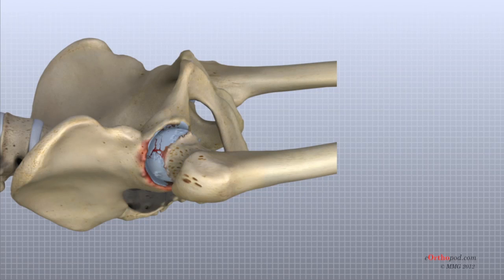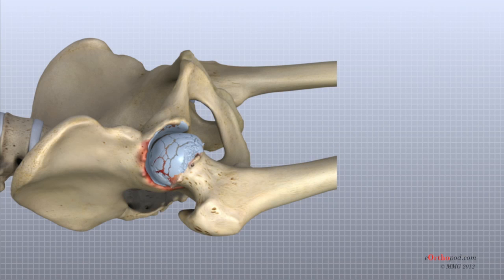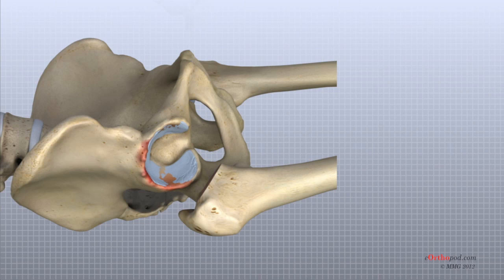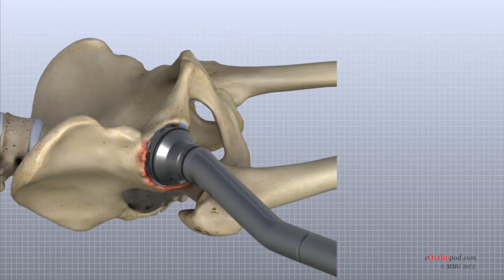Once the hip joint is entered, the surgeon dislocates the femoral head from the acetabulum. The femoral head is removed by cutting through the femoral neck with a power saw. Attention is then turned towards the socket. The surgeon uses a special reamer — a cutting tool used to shape the bone — to remove cartilage from inside the acetabulum.